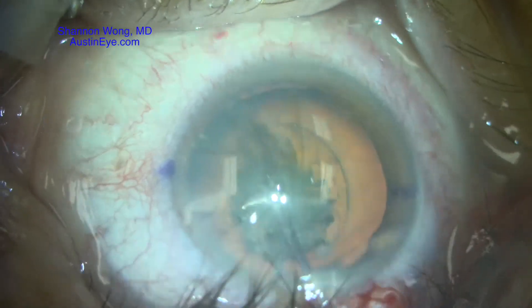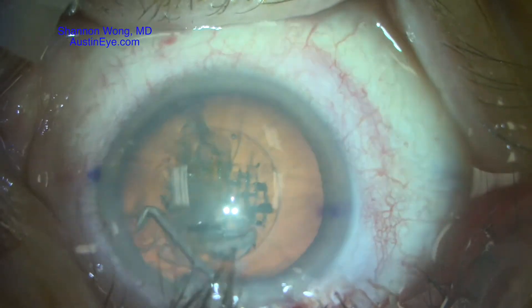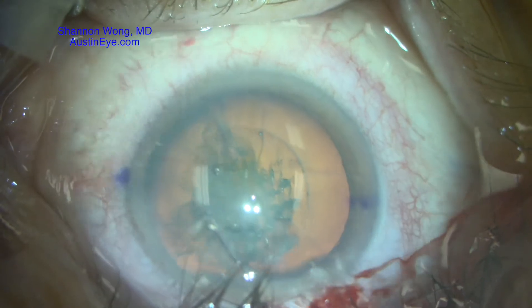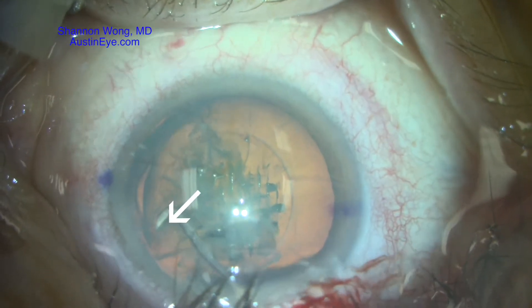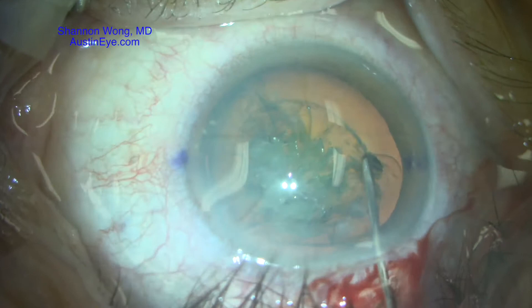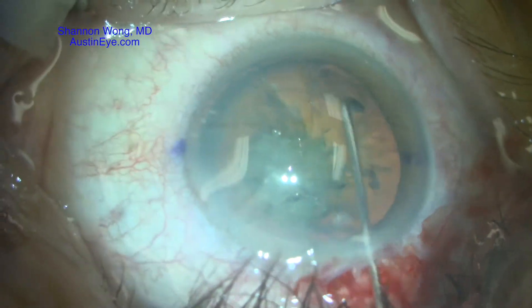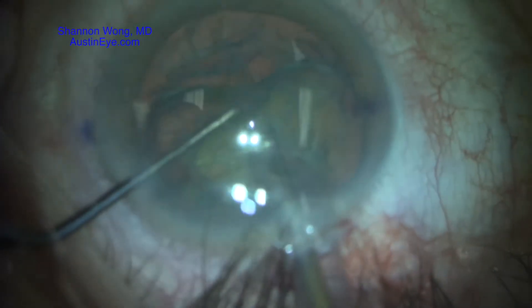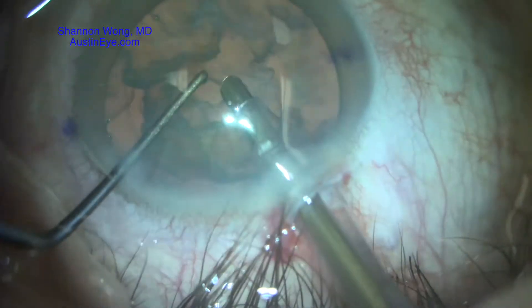As we create the hydrodissection wave, we discover that there's an extension of the anterior capsule in this region right here. We look at it carefully, and at this point we're not sure if it's just an extension of the anterior capsulotomy edge or if it's residual strands of cortex.